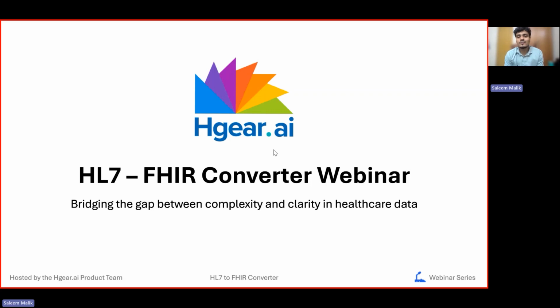So yeah, today's topic is about HL7 to FHIR converter. I mean, HGear's HL7 to FHIR converter, which is a product developed by Agilix Health. Before moving directly into the topic, I just want to take you through what Agilix Health exactly does.